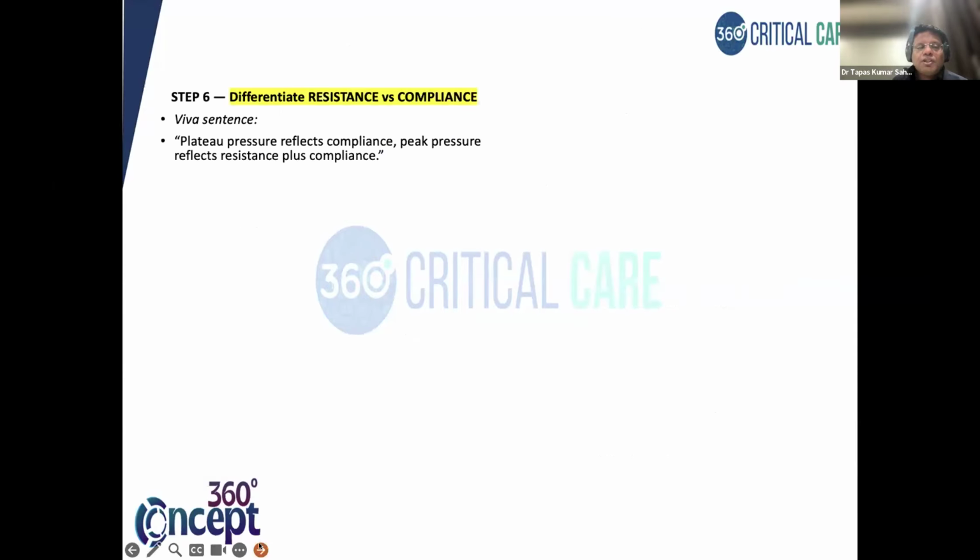Clear? Now coming to step 6, you have to differentiate between resistance versus compliance, because from the inspiratory and the expiratory analysis, you now have an idea whether the problem is related to resistance or compliance. In the examination, believe me, they would expect plateau pressure from you in a very clear and concise manner, reflecting the compliance. Peak pressure reflects resistance plus compliance. Peak pressure is never only resistance. If your plateau pressure is rising, as a result, what would happen?